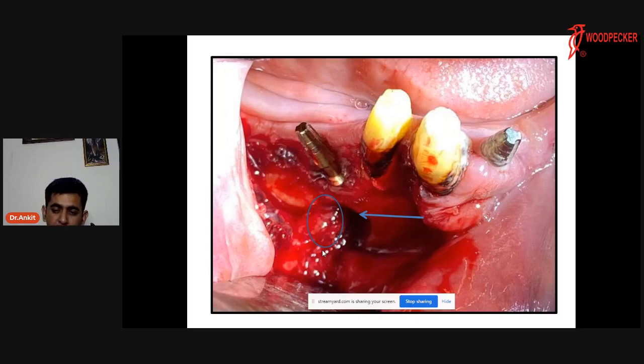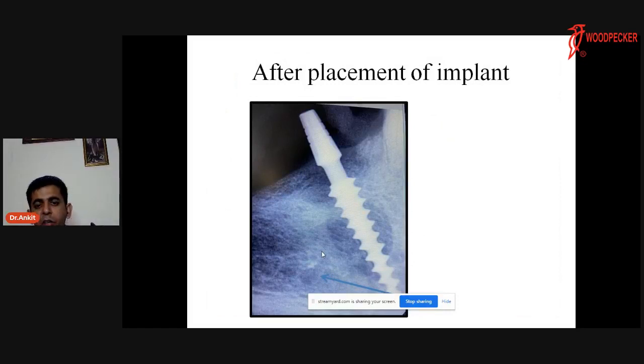So what we have done is the proper osteotomy, and we have distalized the nerve here, right? Now in the remaining space we can put our implant, and you can appreciate where we have distalized our inferior alveolar nerve. This is how we can use a piezotome. At the same time, what we needed is more implant length so that it crosses the mental foramen groove and better engages 3 to 4 mm of bone after the mental foramen groove, so that we get good primary stability. And we should be very sure that our mental foramen is on the distal of our implant, right?